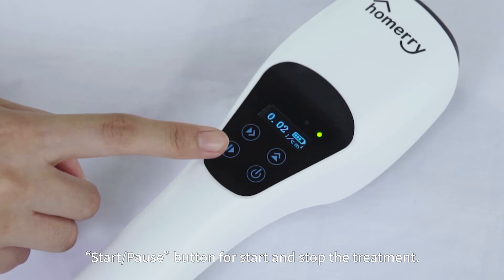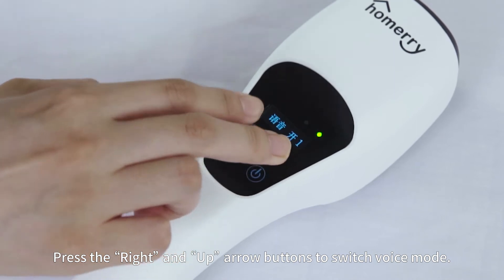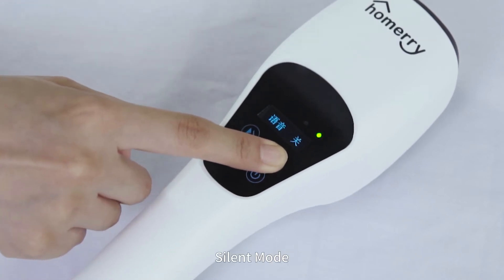Press the Start/Pause button to start and stop the treatment. Press the Right and Up Arrow buttons to switch voice mode: Artificial Voice Mode, Beep Mode, or Silent Mode.